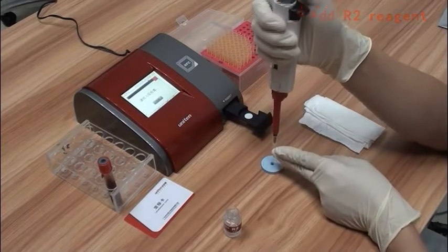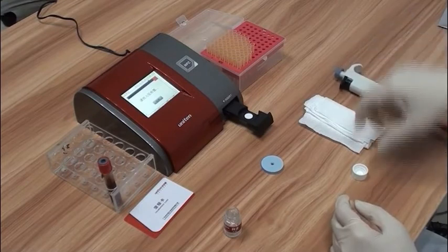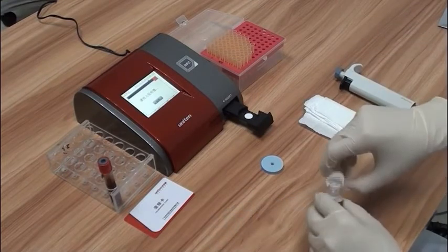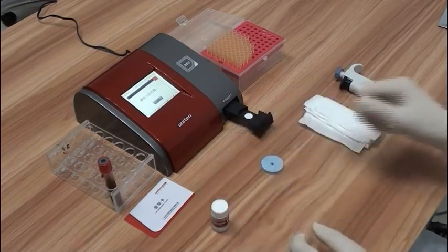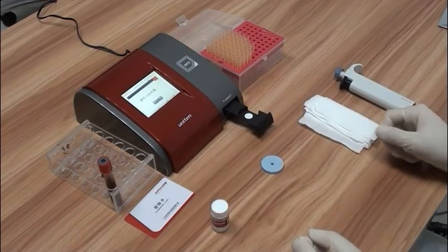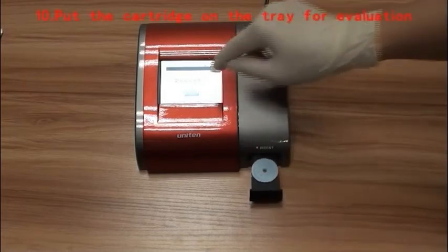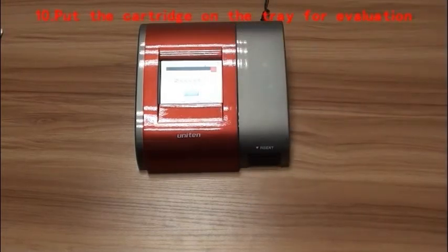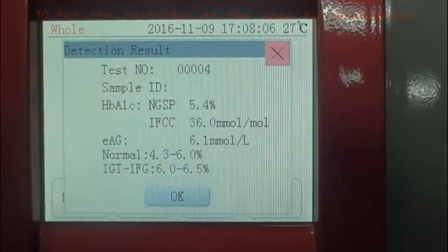Please note that the pipette should be vertical while adding the sample, and do not press the pipette too hard or intermittently to avoid the formation of air bubbles. After the R2 reagent has been absorbed completely, put the cartridge into the tray of the analyzer and click test. The test result will be displayed on the screen in just 7 seconds.